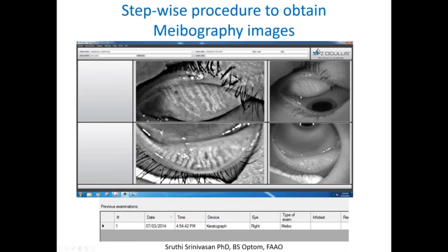After capturing the upper and lower lid images, the infrared image is shown on the right and the binarized version on the left. In this particular patient, you can notice gland dropout in certain areas as well as in the lower lid where some glands are missing. Capturing this image takes less than a minute per eye, so it's very quick. You may need help or assistance in holding the upper lid, but with practice it shouldn't be a problem. Simply hold the lid in place, ask the patient to look down for the upper lid image, and look up when the image of the lower lid is captured.